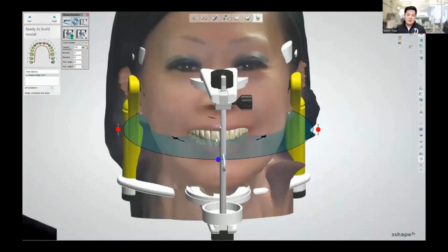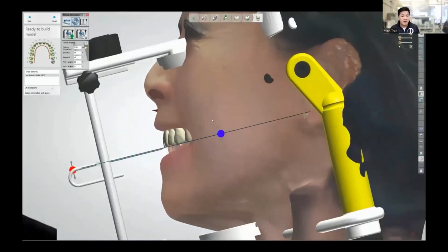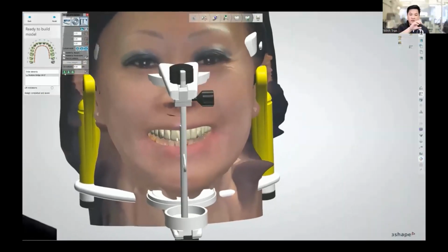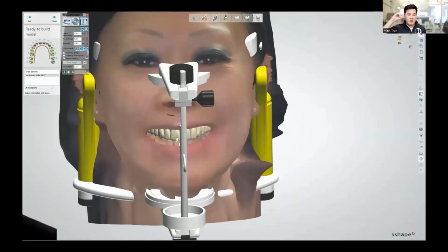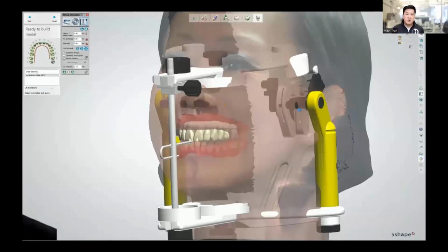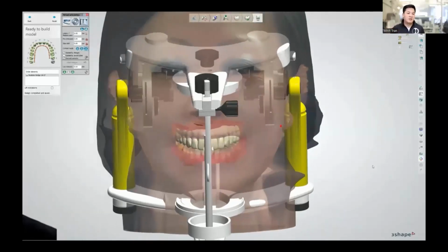And the reason I do this rather than using a traditional implant workflow is because number one, the implants are buried. But number two, temp on prep, like I said, it's very free form design. You're able to just focus on the aesthetics, the function, how everything flows. You just make this big giant pontic for the gingival, and then you're able to sculpt it as much as you want. It's not going to give you any errors of, well, you didn't define the spline wide enough for the implants to be accommodated, or there's less holes than expected. And those are very common errors that you encounter with 3Shape when working with any kind of gingival workflow.